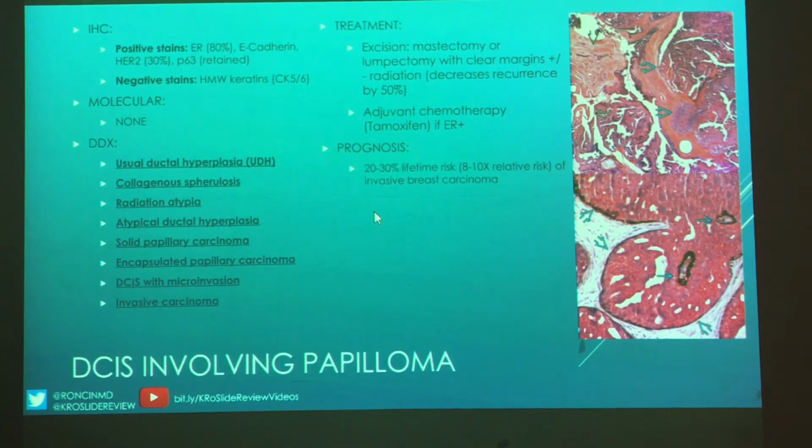Okay, so DCIS, most of them are ER positive. Some of them can be HER2 positive, but do we do HER2 on DCIS? Do you normally order HER2 if we have a DCIS case? I'm going to say no. No. And it's pretty much like, if we have HER2 positivity, well, what do we do with that? What does it really mean?